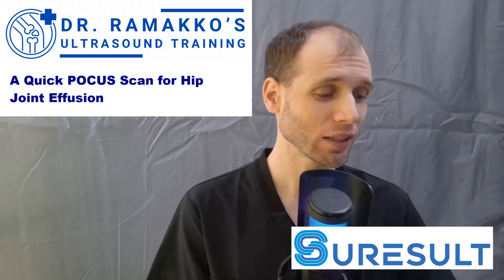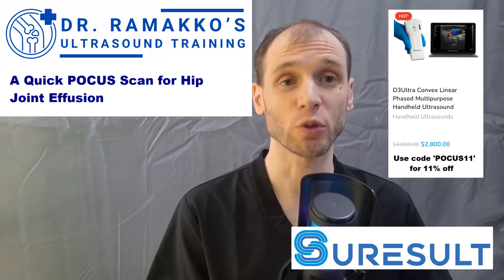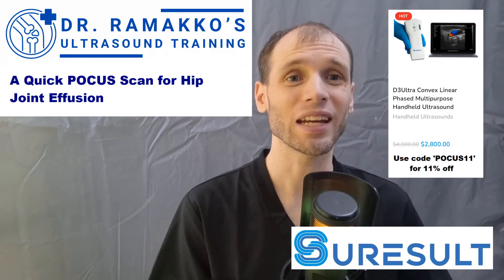My name is Baron Romacko and today I'd like to use a SureResult D3 Ultra handheld ultrasound to check a hip for joint effusion. This is a nice quick scan. Typically you can use a curvilinear for this. You can sometimes get away with a linear, particularly if your model has a trapezoid view. This does not have a trapezoid view, but I do have the curvilinear — that's the advantage of having a dual-ended probe.